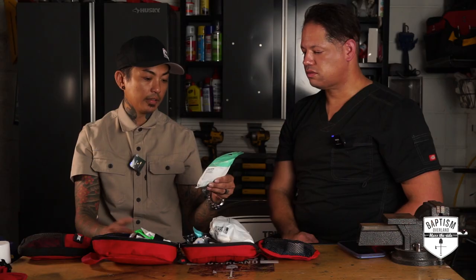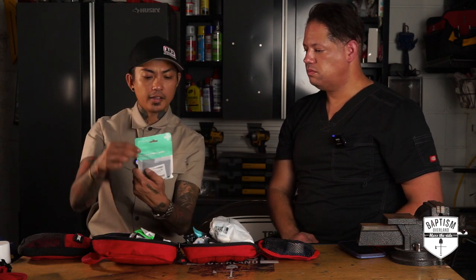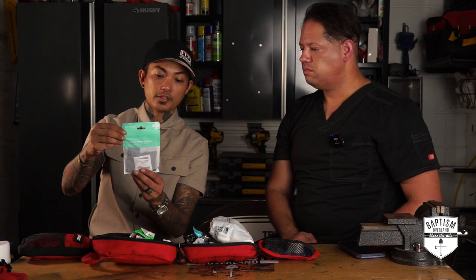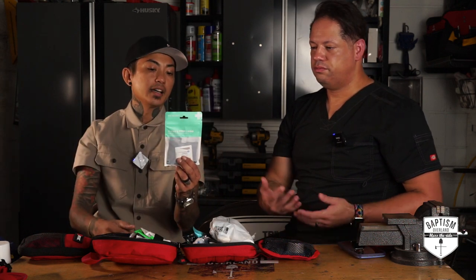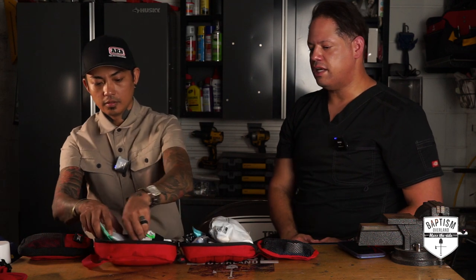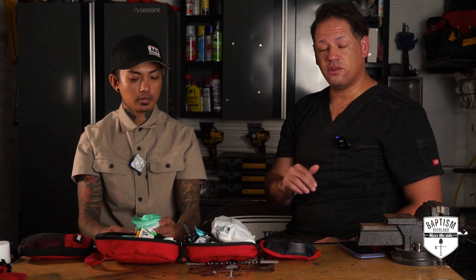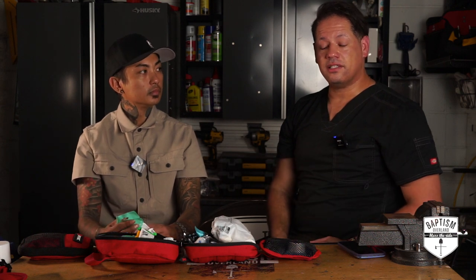Clean and Prep Mod — basically iodine prep pads and some topical stuff. This has four antiseptic wipes, four hand sanitizers, and one iodine prep pad. That's just to keep wounds clean and get all the bacteria out. Pretty standard, although I've never seen iodine in a first aid kit before. And you never want to put iodine inside of a wound — you always want to put it on the outside of the wound to cleanse the skin. Never stick iodine inside a wound.